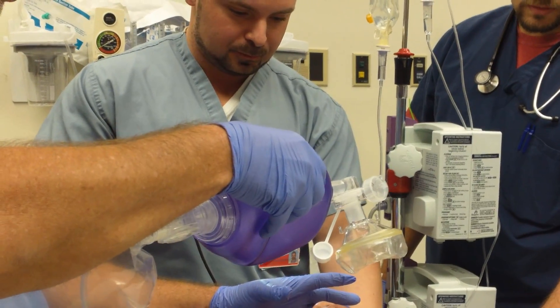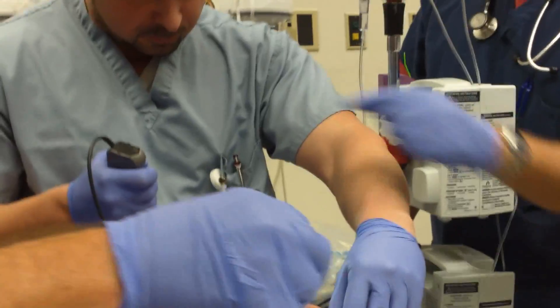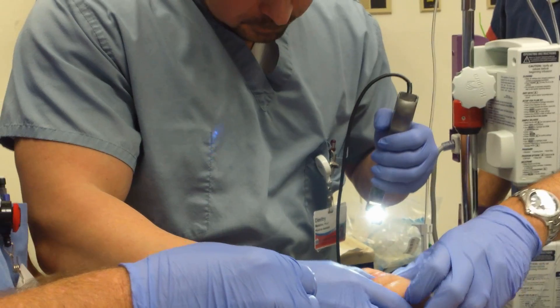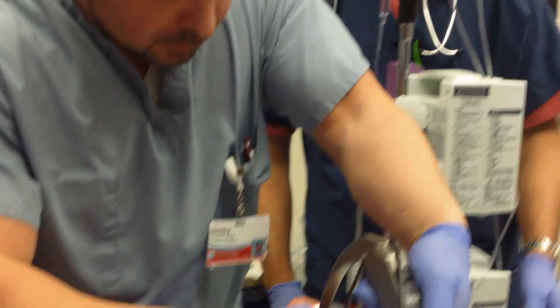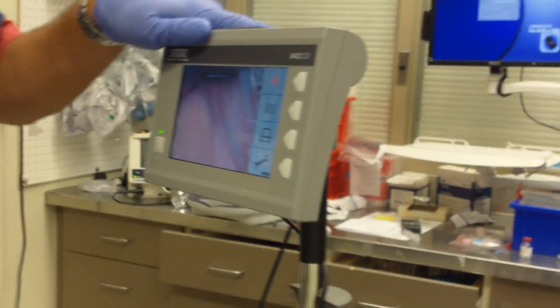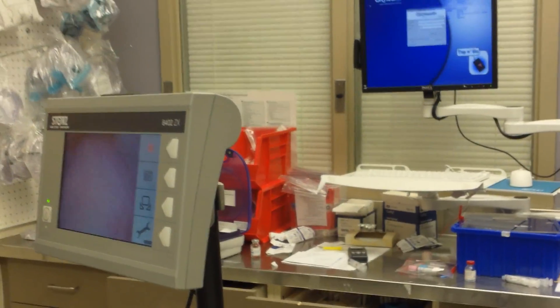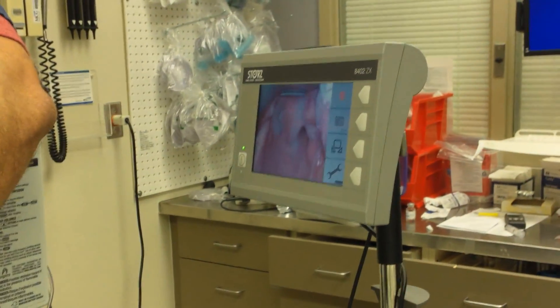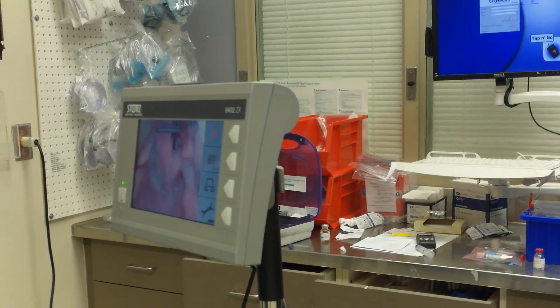Unless we gave her — was it reversed? Feel her drawing. She feels like she's nice and light. That's in your left hand. You can just stand there with your right hand. Make sure you don't rock back into the teeth. Come back a little bit. There you go — you've got two cords in right here. As he opens the side, he's actually not directly on that; it's a little slightly to the left.